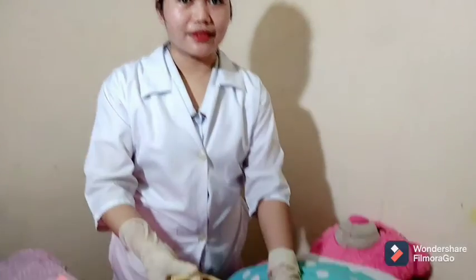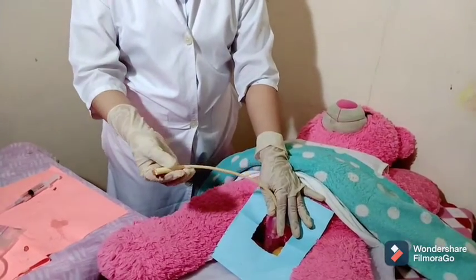Hold the catheter securely with your non-dominant hand while the bladder empties. Collect a urine specimen of about 20 to 30 ml as needed. Move the catheter smoothly and slowly. If a straight catheter is used, the catheter is only needed to drain urine present in the bladder and is not intended for continuous use.